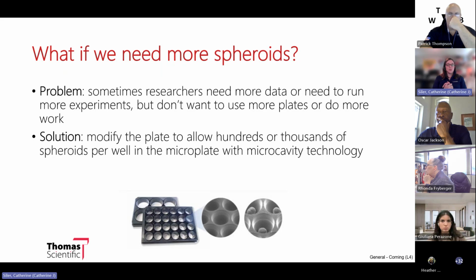So what if we just modify the plate? Instead of one spheroid in every well, what if we could have hundreds or thousands of spheroids in every well? We're going to do that with microcavity technology.